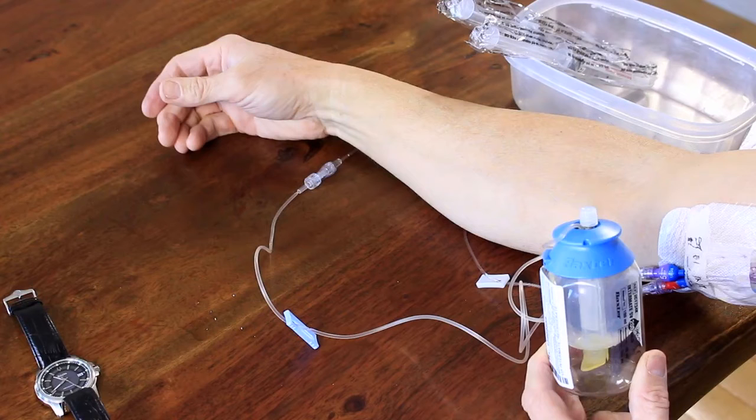And you want to make sure that the tubing doesn't get kinked or folded over, or that you're lying on it or sitting on it, because that can stop or slow down the speed.